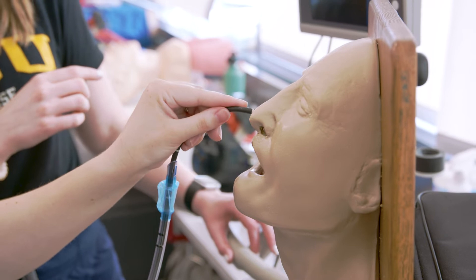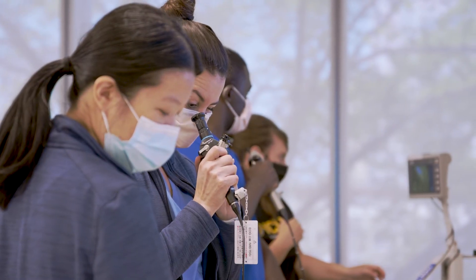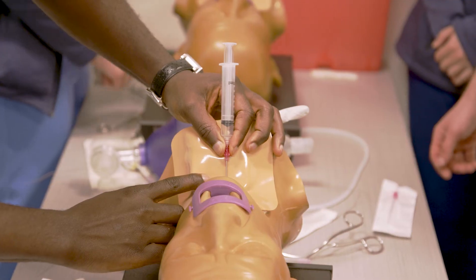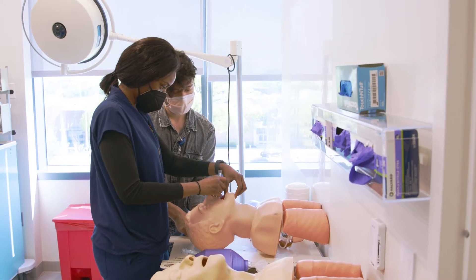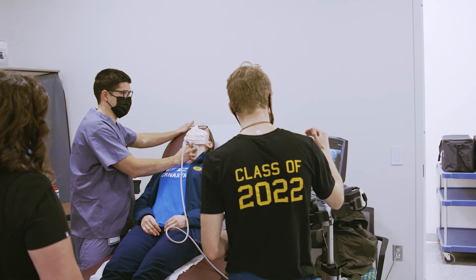The sim lab is always available to the students, so if they want to practice things above and beyond what is in the program, we have a mechanism for that, and the students do make use of the lab quite a lot. You want the students to be able to practice those skills that will degrade over time. Laryngoscopy — looking at the vocal cords — is something you want to practice a lot. Ultrasound: you only get better by doing it a lot.